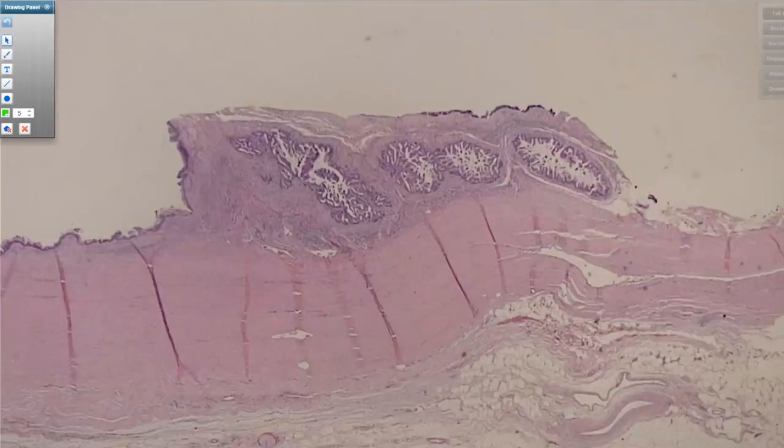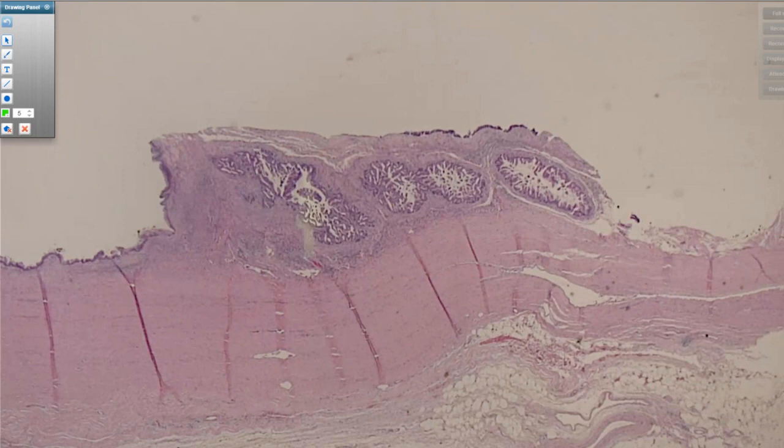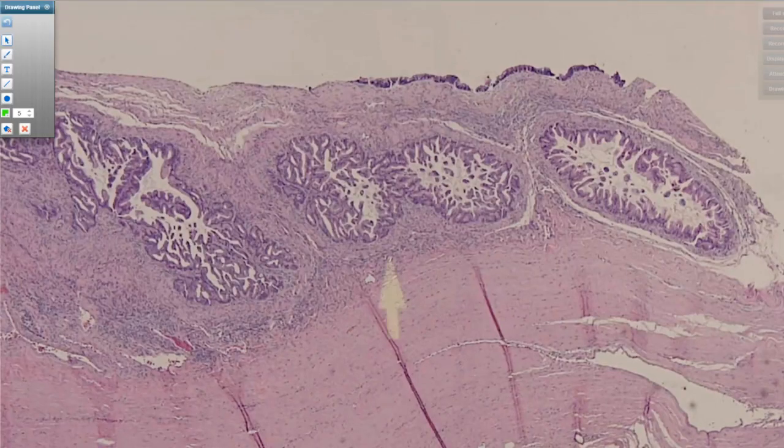Let's have one other example. If you have a little bit of budding and then it gets cut a little bit tangentially, again, it can look concerning for invasion, but you can still draw nice round circles on these duct areas. Again, the ovarian stroma surrounds everything. You don't have any true invasive growth popping off of it.